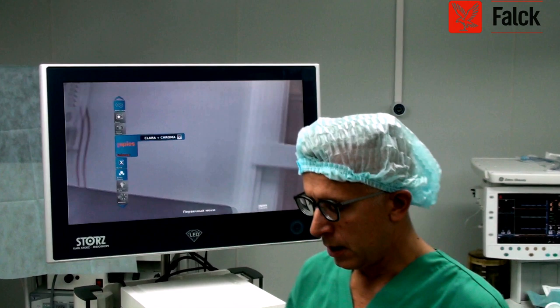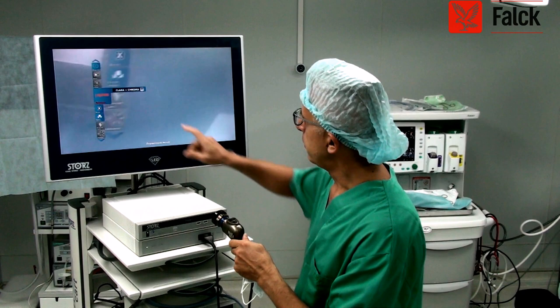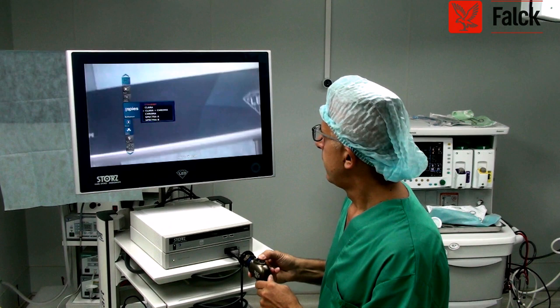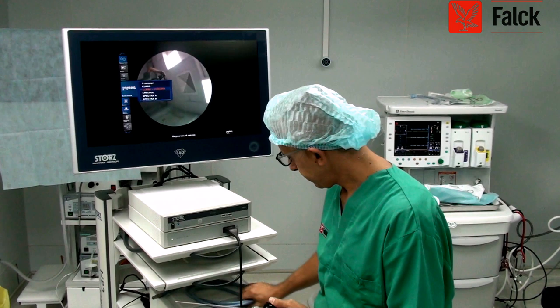I'm trying to use a scope — the pediatric scope will be okay. With the menu, if you see here, you have Clara and Chroma. You can switch to the standard, okay? Then we have Clara, and then Clara plus Chroma, where the red is a bit improved or enhanced.